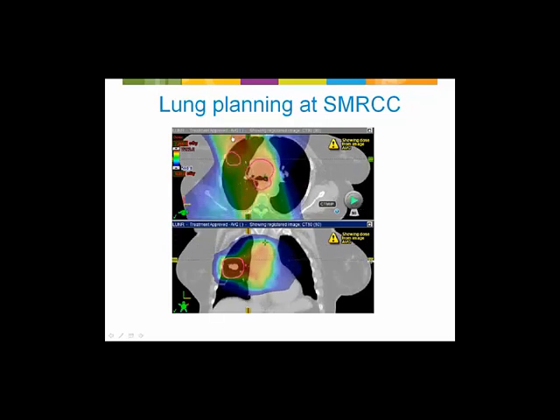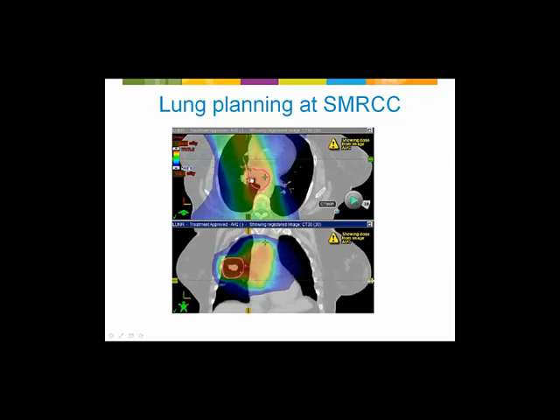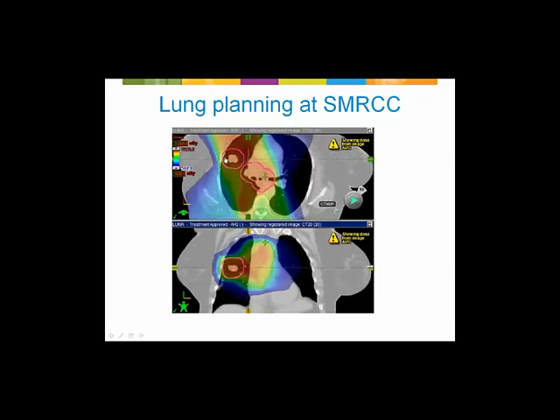The prescription is simple. 60% of the dose per fraction is prescribed to midplane in the center of the field. And then we don't fuss with this plan at all, really, for target coverage or uniformity or anything like that. But we need to make sure that we leave some for the OARs in terms of the additional dose that they're going to get from the RapidArc.